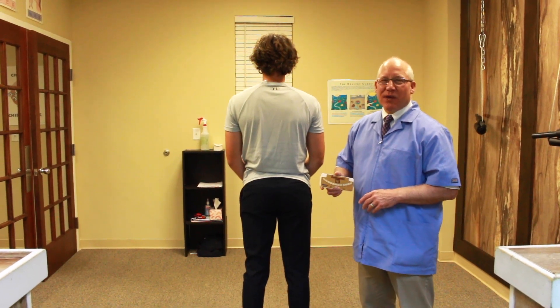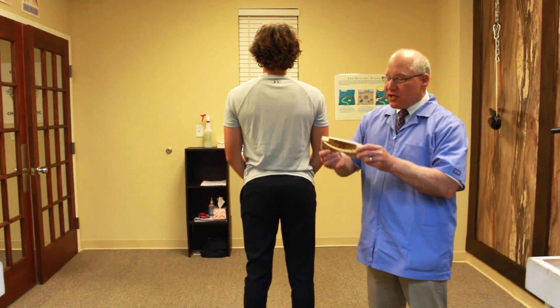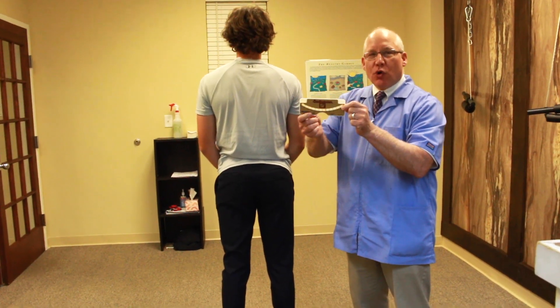Hello, this is Dr. Jay Hartley at Hartley Chiropractic Scoliosis Center in St. Augustine, Florida. Today we're going to be teaching you about the scolimeter.